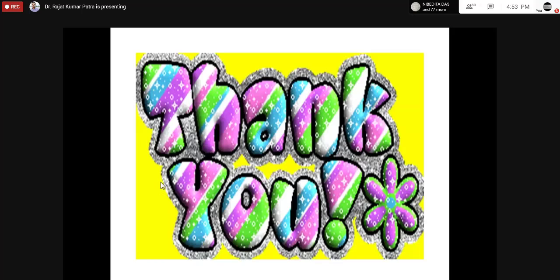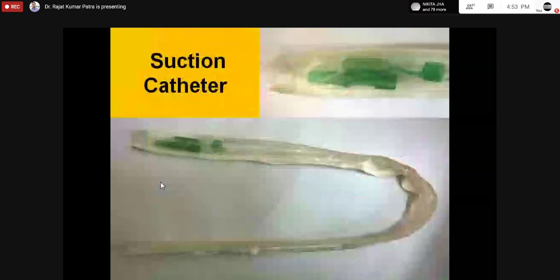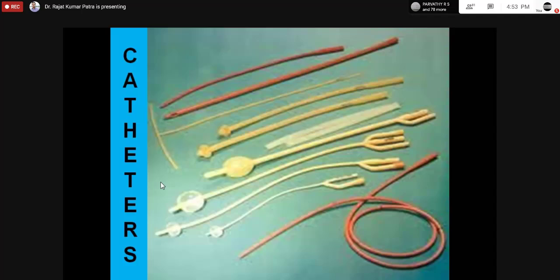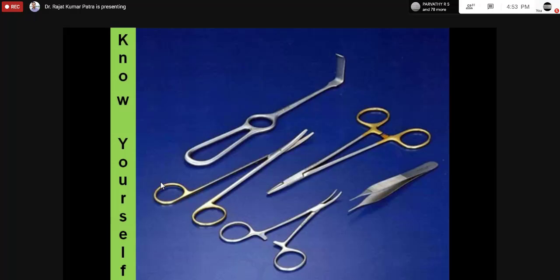This much will be kept, okay. The instruments we've shown, and these drains: you will get a Foley's catheter, Ryle's tube, suction catheter may or may not be there, then corrugated rubber drain, okay. Any question? We are very sorry, because once you come and hold the instrument, then only can we explain better, okay.